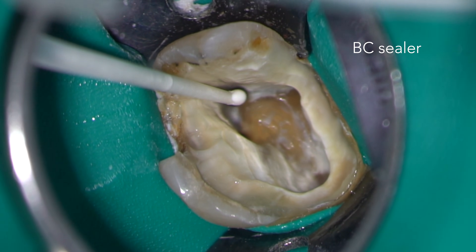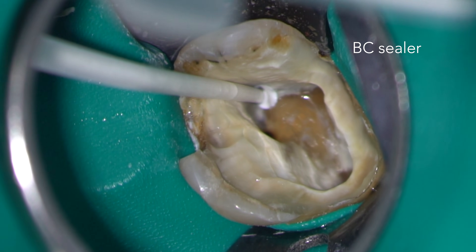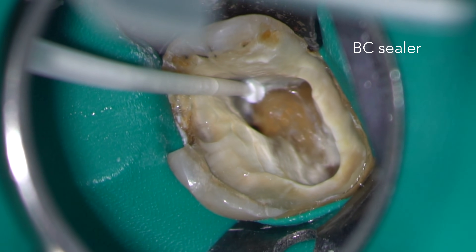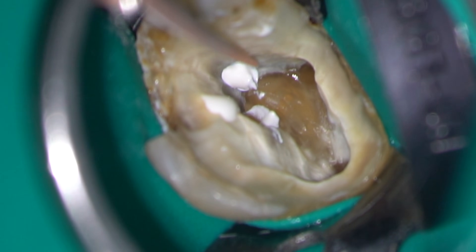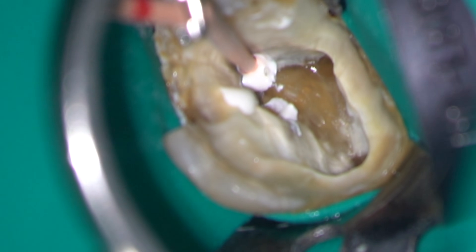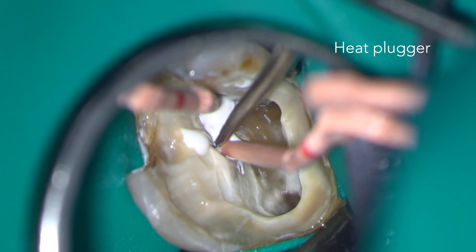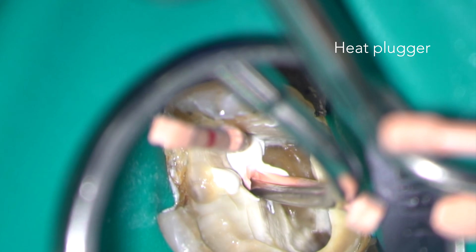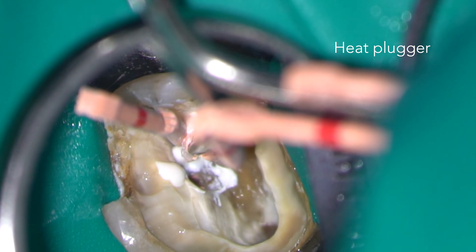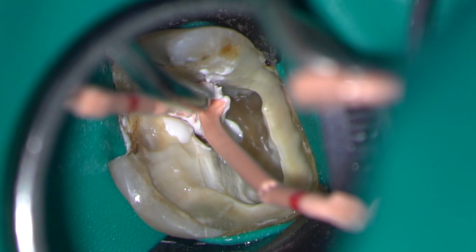After drying the root canals I'm going to obturate them using a BC sealer and gutta-percha technique. Here some sealer is introduced into the coronal part of the root canal. GP cones are gently inserted through the BC sealer to the full working length — in doing so they will carry sealer right to the apex. I'm now using an electric heated plugger to condense the coronal part of the GP in each of the canals. These will then be plugged with a cold plugger.